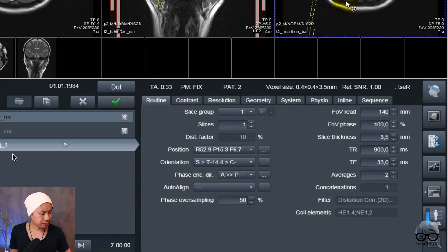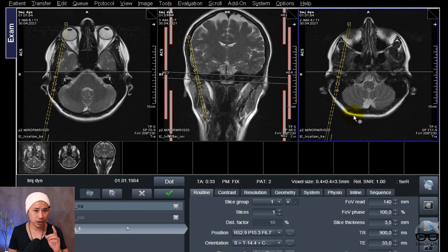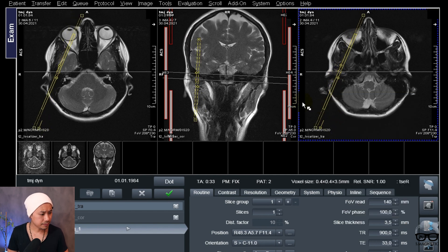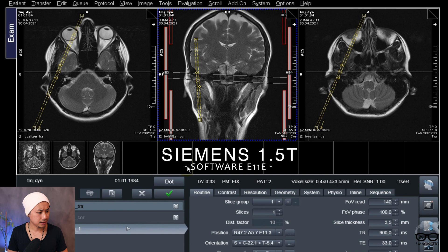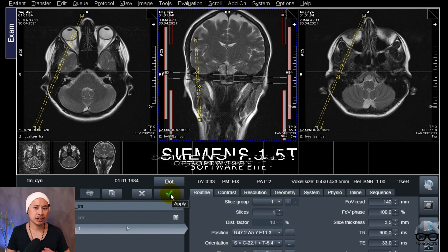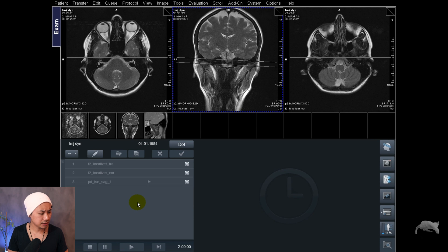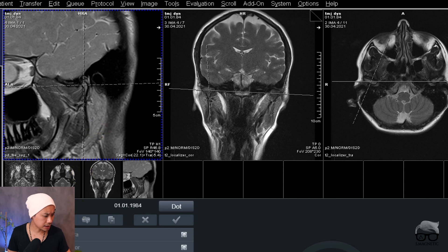The next thing I'm doing now is positioning the only one slice on the right TMJ. In this example — and I also have to mention that this was done on a 1.5T, but this is also possible at 3T. I'm going to apply this one to check the quality of this sequence. Let's check it now. You can see here the TMJ comes okay — good, you can see it right there.